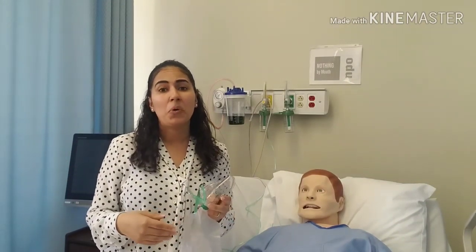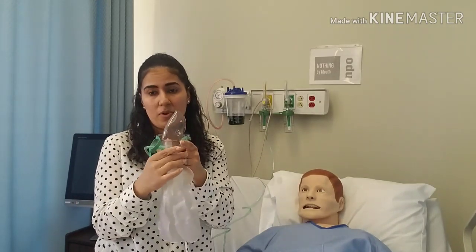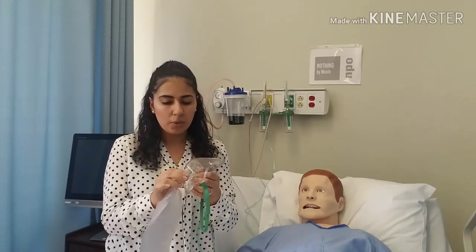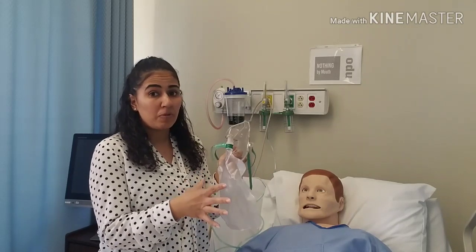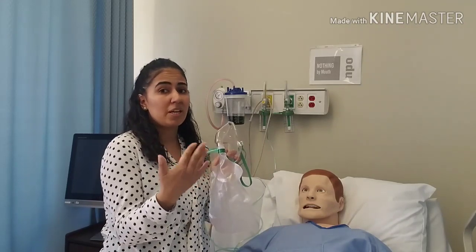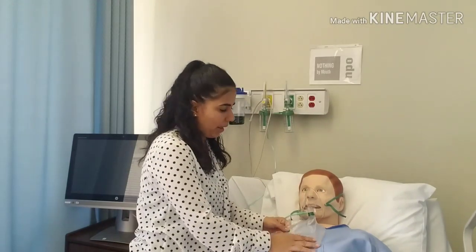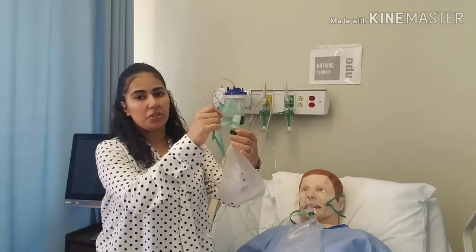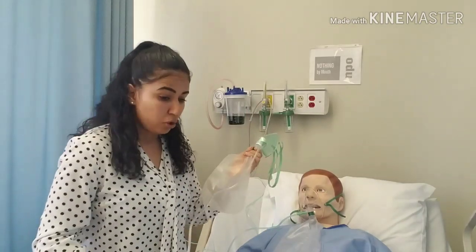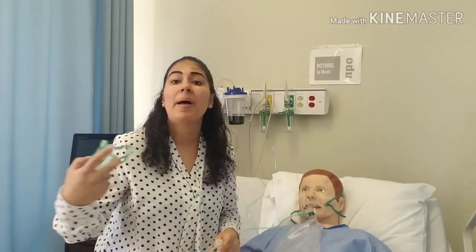It's important to note this patient is still breathing on their own. Once connected, you want to see the bag inflate — it should inflate about two-thirds with each breath. We don't want it fully deflated like you see on TV. Here's also a pediatric 100% non-rebreather — remember to choose the appropriate size for your patient. This device is used when giving 100% oxygen before getting BiPAP on board, before intubation, or while treating acute respiratory distress.